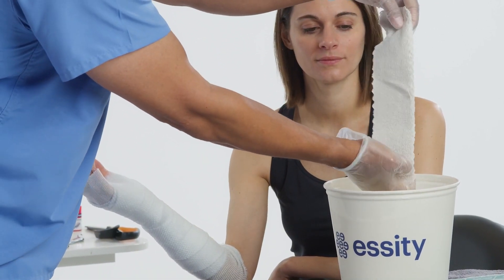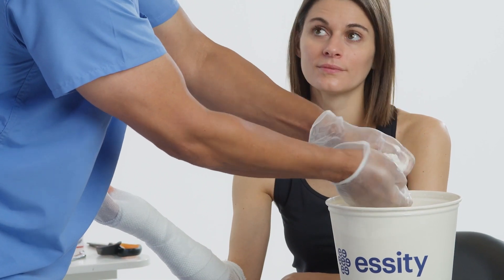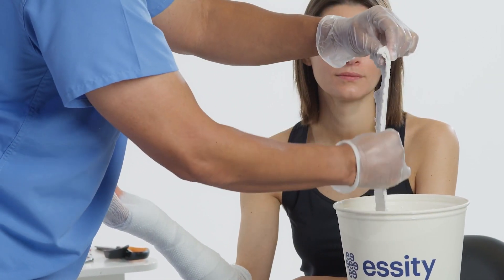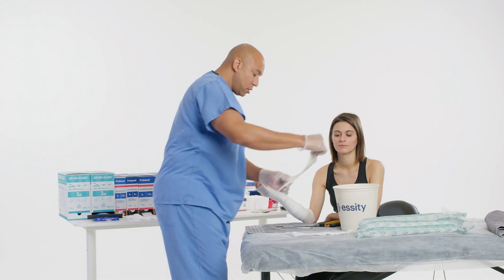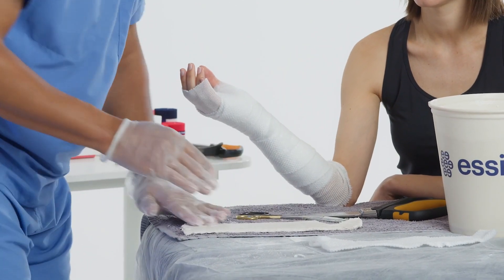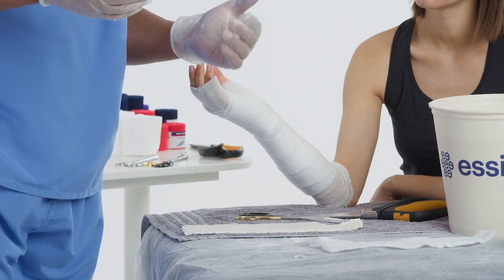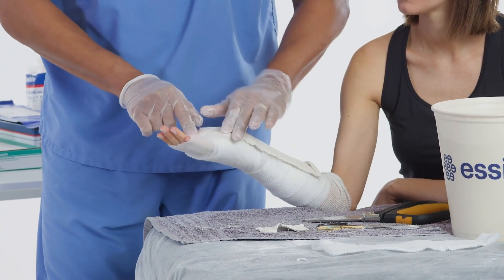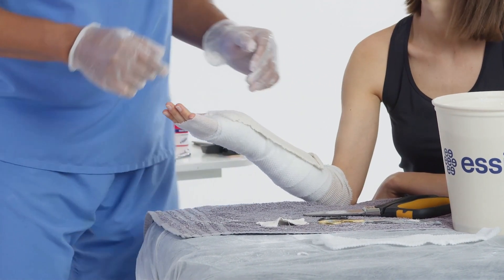Dip it in the water until the bubbles cease. Notice that it's all together. We're going to do a little accordion fold and mash it together, getting a little bit more extra water out of it. Now we're just smoothing it out to make sure we smooth out all the plaster and the impregnated gauze. That ensures you provide extra strength by pushing those layers together. Next, fold this down — this end is a little bit too high on the distal palmar crease — to allow for full range of motion for the patient.